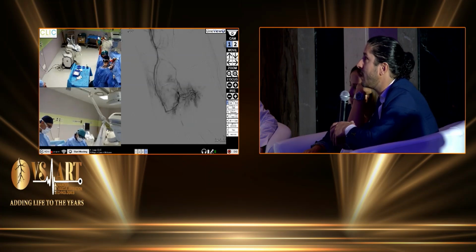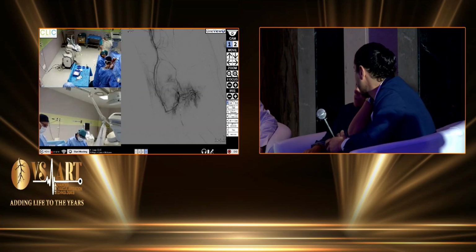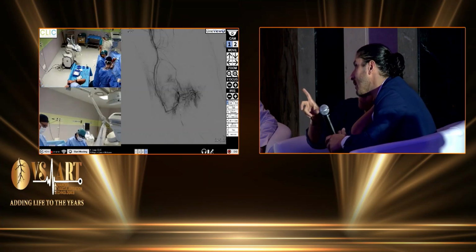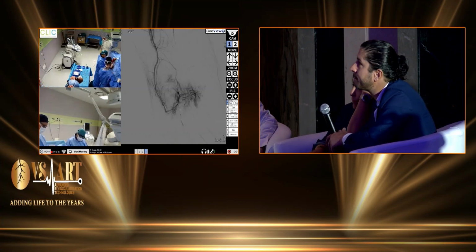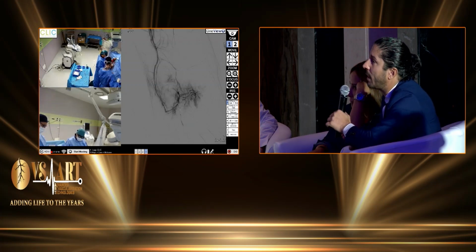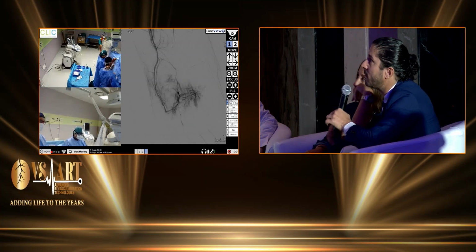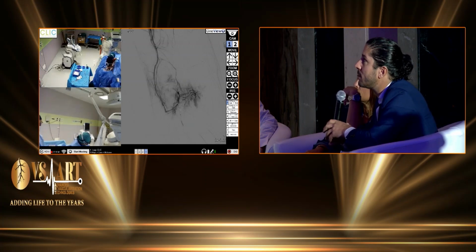But again, I still believe it was not reported, but only gangrene of the rear foot and the forefoot. Yeah, it would be nice to be able to see the foot if you can in some way. Stefano is going to show it. In the meantime, remove the band.